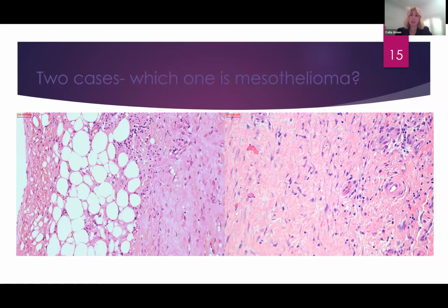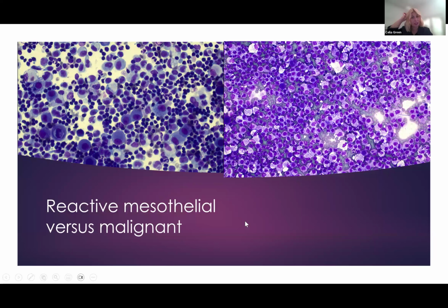So when we get the biopsy and we say, look, it looks like a fibrinous pleuritis, but we do have to do some more work and make sure. This is the situation we're seeing, where you've got this organising phase of a fibrinous pleuritis, which can mimic a desmoplastic mesothelioma, and we're just making sure that we're not missing anything. Now, I did this yesterday and I used 2 benign cases, and I've actually changed over the picture today. So we do actually have 1 reactive and 1 malignant case.